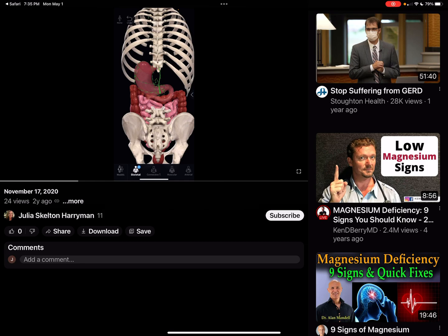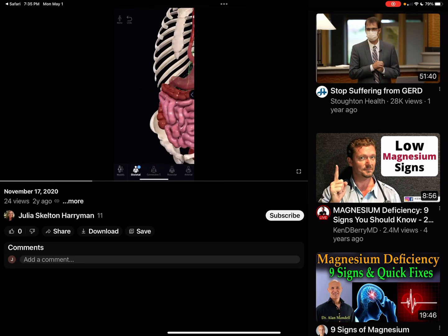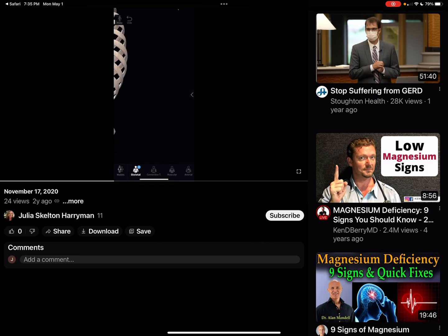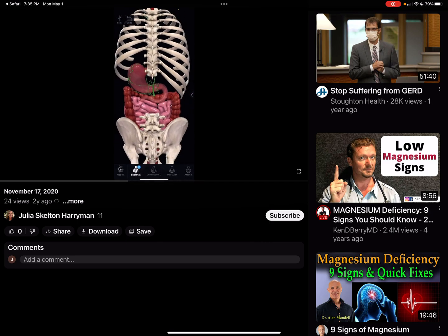So this is a patient. What I did is I rotated the patient around. We were in an AP position, and now I'm going to rotate them around. Now we are in a PA position, and as you can tell, the pylorus is superimposed by the spine.